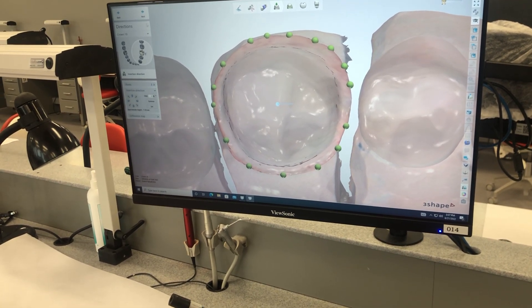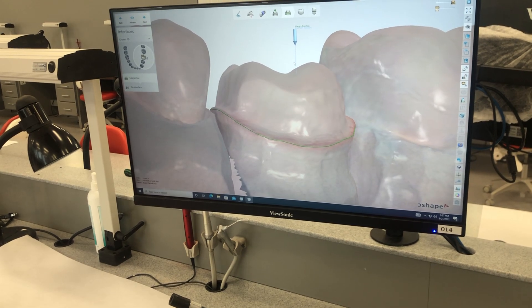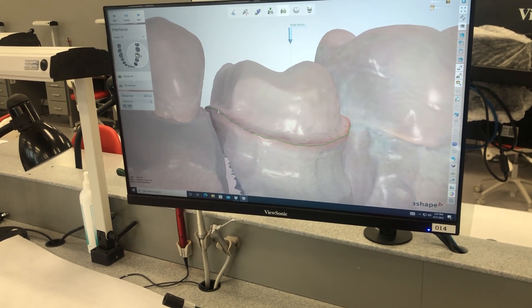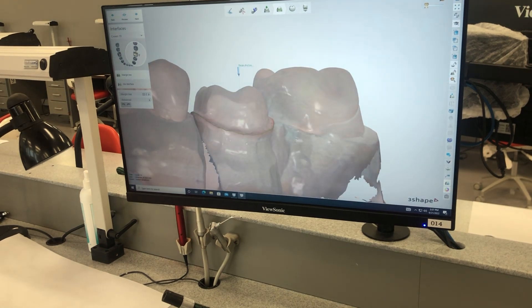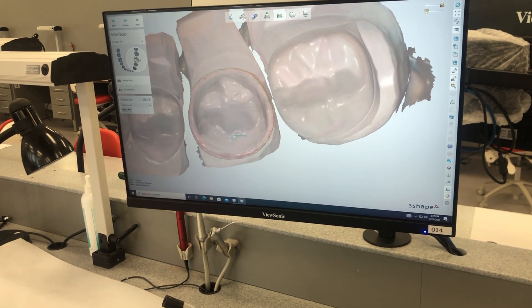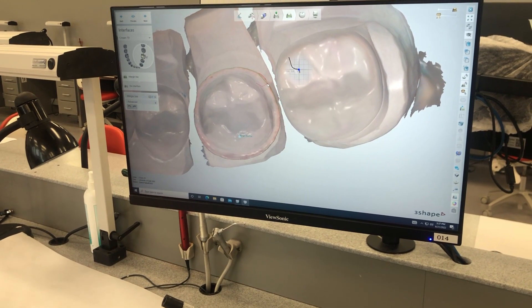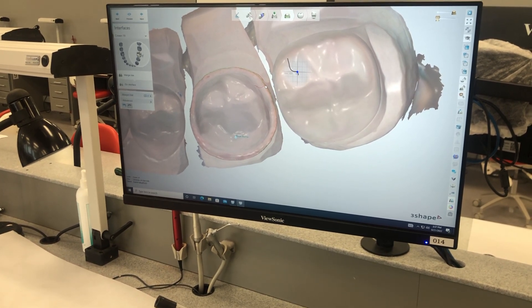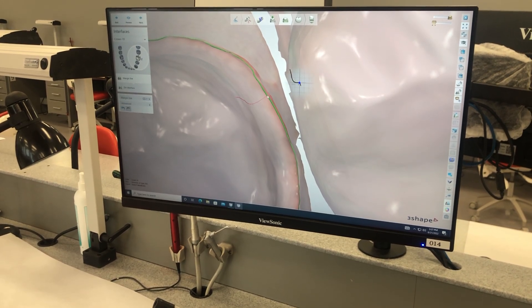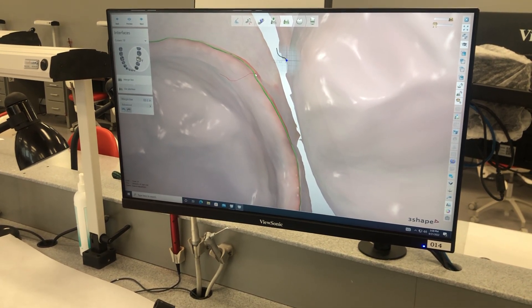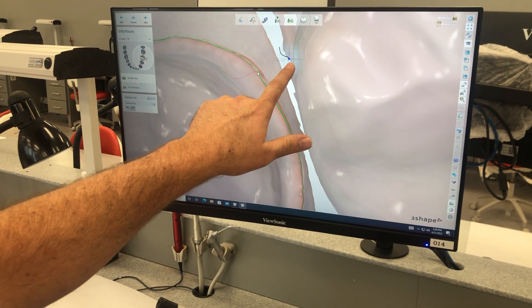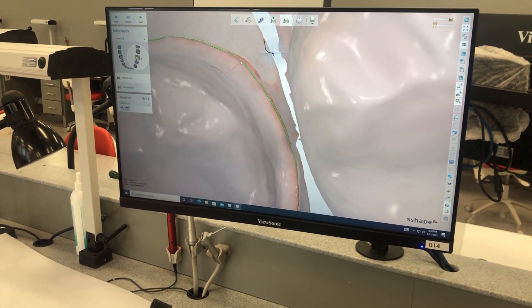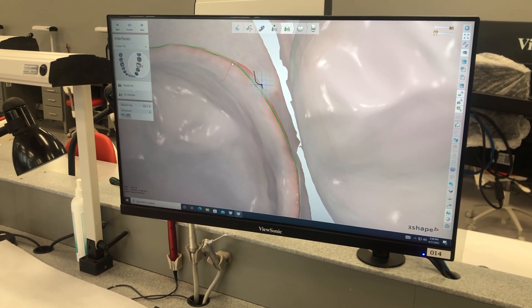So we finished with that part. Now we're just going to keep clicking next, showing our margin insertion, highlighting our margin line and our die interface. You can see we're a little shy right here — we're going to re-mark that. You can also just drag and double-click to mark your line. On that cross-sectional view, I came over the margin, so we don't want that. We want to click right on that margin.